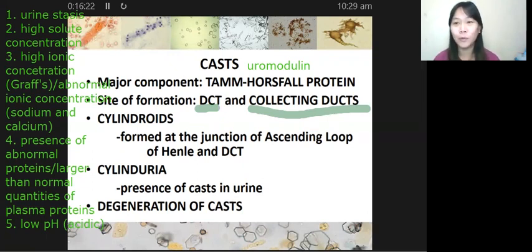Okay, ayan. Oh, new word, propensity. Di ba pag sinabi mong propensity, they have a higher likelihood for something. And in this case, your casts, they are distributed in the edges of your cover slip. Okay, so kung kunwari man na in the laboratory, you are expecting to see casts in your urine sample, ano ang unang gagawin? Make use of your subdued light and then scan the edges of your cover slip. Kasi nandiyan, okay? Nandiyan usually yung mga casts natin.